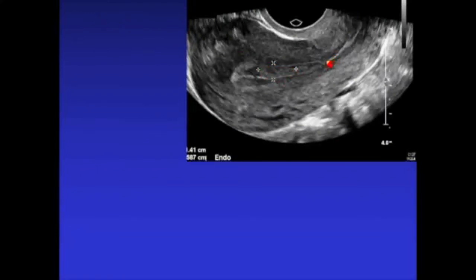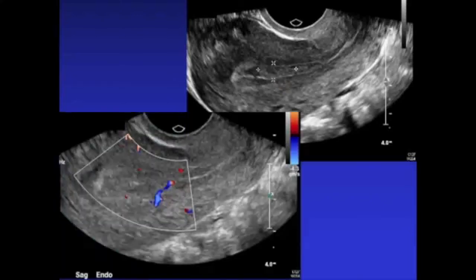Well, if you look at the endometrial echo in the mid-uterine cavity, and it is within the endometrium itself, that must be retained products. That's not blood clot. Blood clot is going to distend the endometrial cavity. It won't be just on one side like this. So I know, well, maybe she had a polyp before she got pregnant, but since she's recently been pregnant, it's likely retained products.